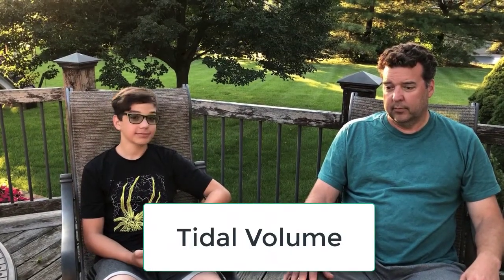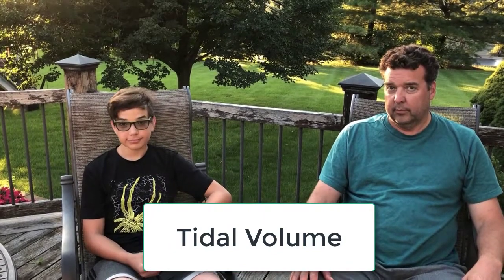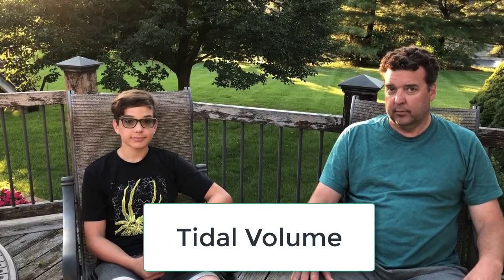But what we're going to do is measure two different types of breathing today. As you should already know, because you've read the course pack, tidal volume is the volume of air that you breathe in and out just normally. So as you're sitting there listening to me, you're breathing in and out tidal volume air. The average tidal volume is about 500 milliliters. We're not going to be measuring that today because that's too small of an amount to measure on our spirometer.